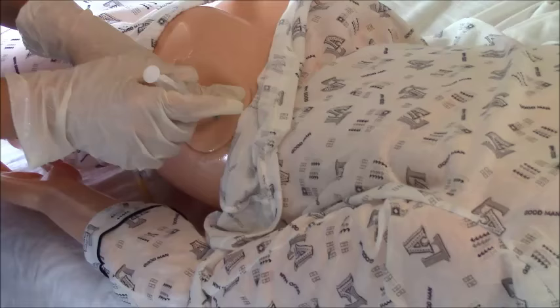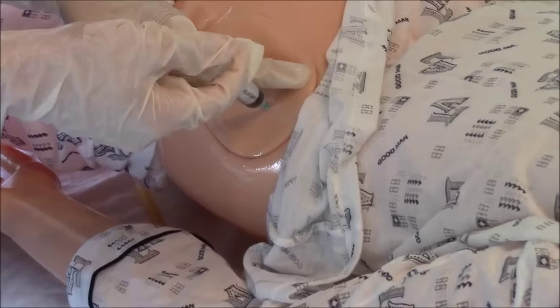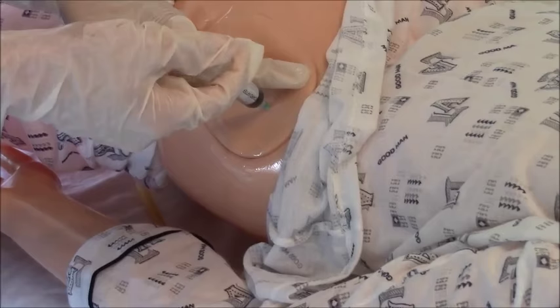You're going to go in at a 90-degree angle and you're going to aspirate, of course, as with all IM injections — make sure you don't have any blood. Just pull back a little bit and we have no blood, so we're going to inject. Keep it there just for a second to make sure all that medicine gets in. You're going to pull out, engage your safety, and put a gauze or a band-aid over the area because it might be bleeding.